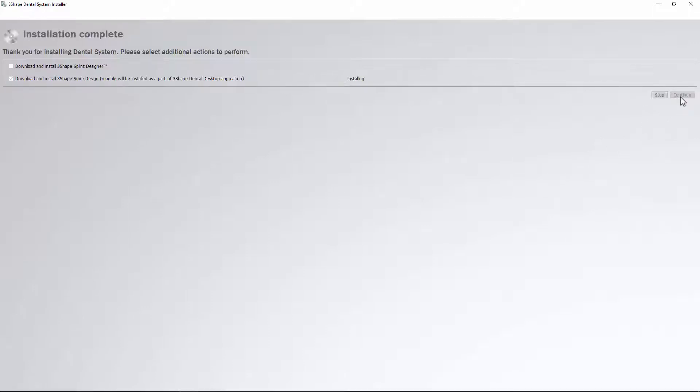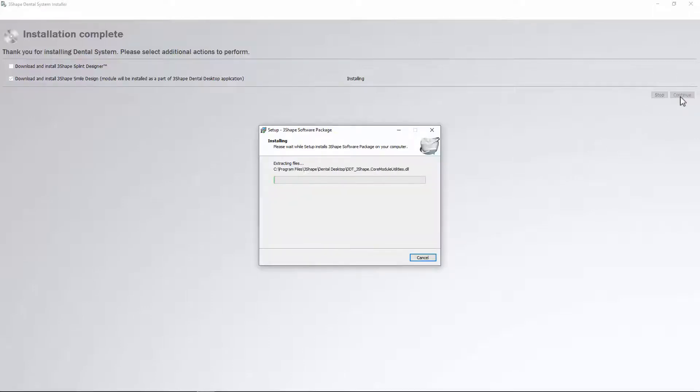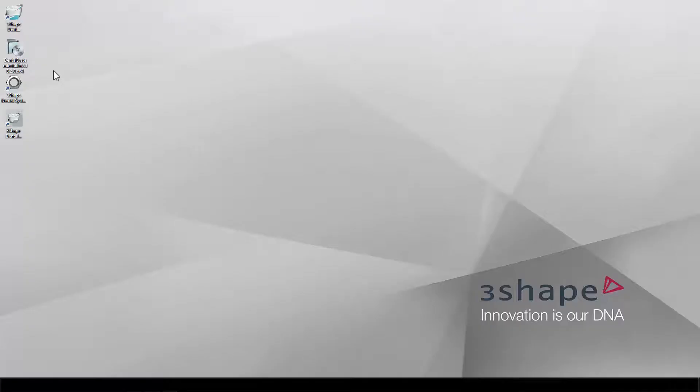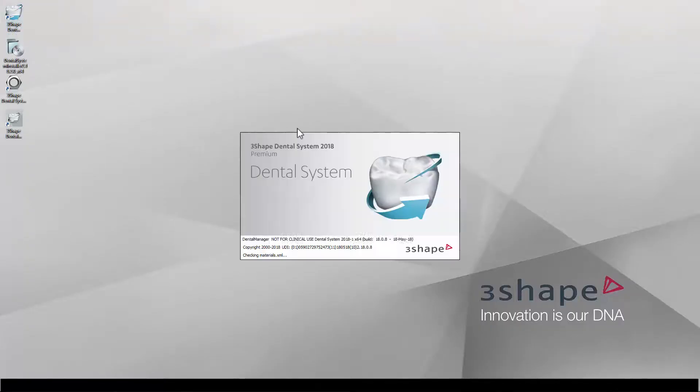When ready, click Finish to end the process. Now you can start working with the software by opening the dental system from your desktop.